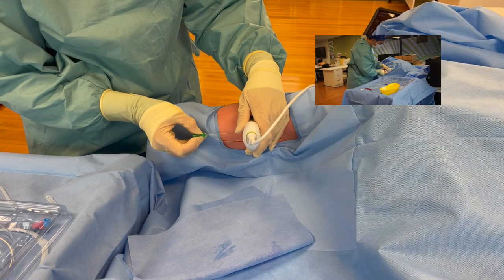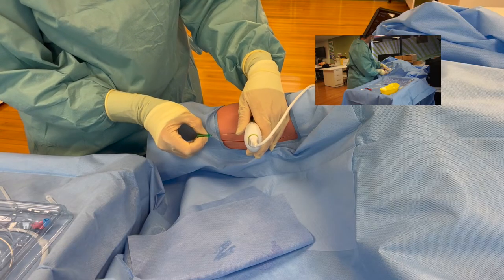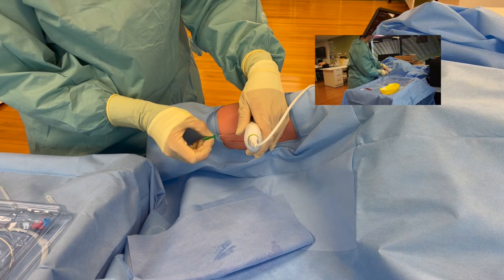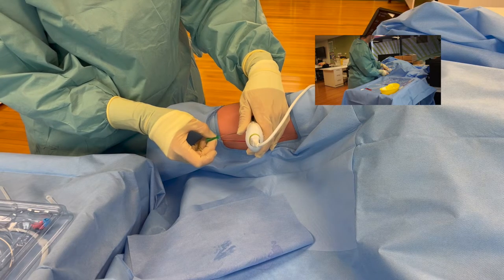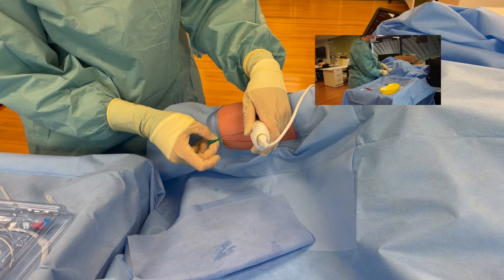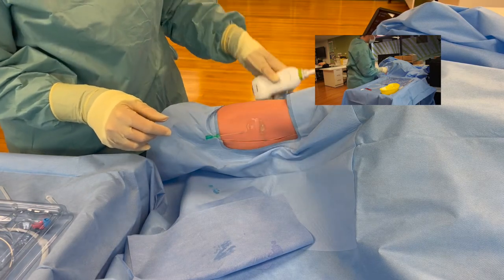Next you will take your needle, go in through your intradermal injection site with an angle appropriate for the depth of your vein, and ensure at all times you can see your needle tip. If you can see my ultrasound screen, I am right on the edge of the vessel wall. I'm now going to slide my probe away a little bit and advance my needle into the vessel. Make sure I'm in the center of the vessel, at which point I should see flashback - which I have - and I can place my sterile ultrasound aside.